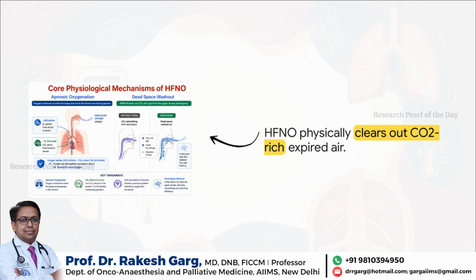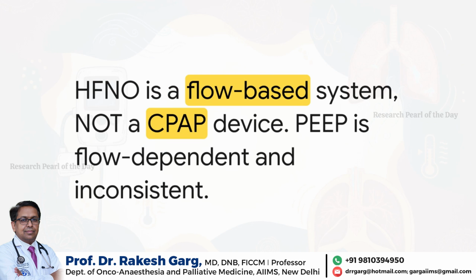And a lot of it just lingers in your nasopharynx and oropharynx, what we call your anatomical dead space. Without high-flow oxygen, you inevitably rebreathe some of that stale CO2 on your very next breath. But by continuously blasting the upper airway with high flows of fresh, oxygen-rich gas, HFNO physically washes out that CO2-heavy air. This dead space clearance makes oxygen delivery so much more efficient and drastically drops the work of breathing for the patient.